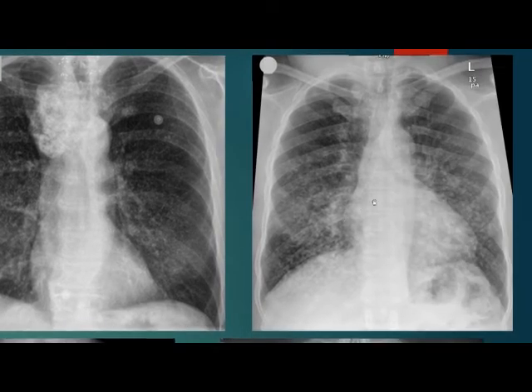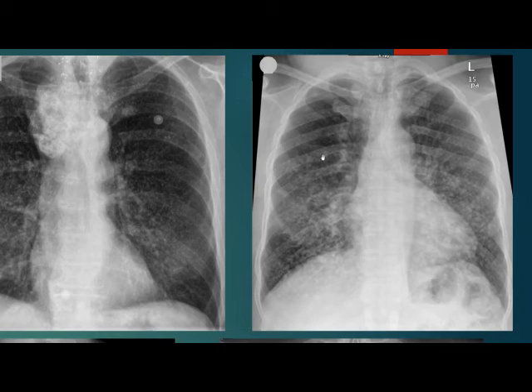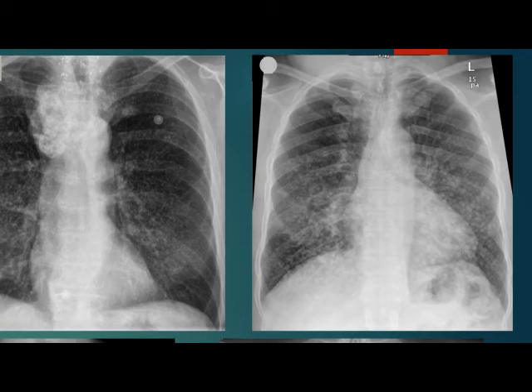In the third case, again there is miliary nodularity. The nodules include some large and some small, with distribution mostly in the lower zones — not typical for miliary tuberculosis. On careful inspection, there is soft tissue thickening in the neck. This is a case of thyroid carcinoma with metastasis.